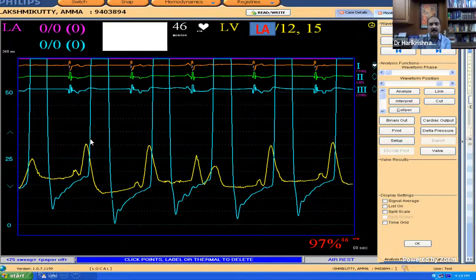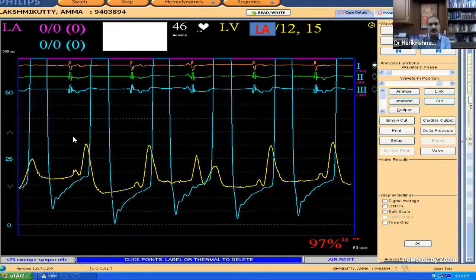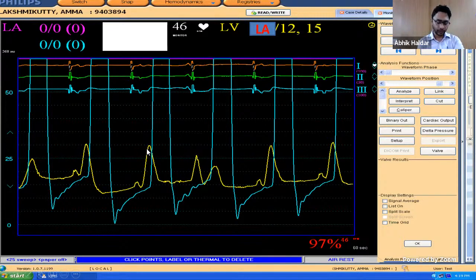There is a junctional rhythm and a prominent V wave. What is happening? Junctional rhythm. What is this wave? It's a canon kind of wave. No, what is this ECG wave? Retrograde P wave. Retrograde P wave, and that is contracting on, and that is producing a large canon wave.